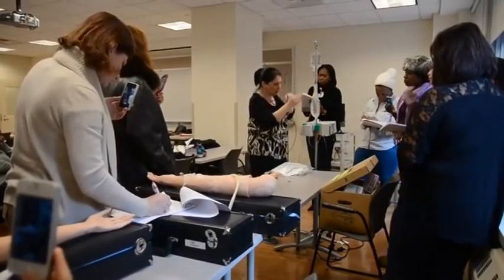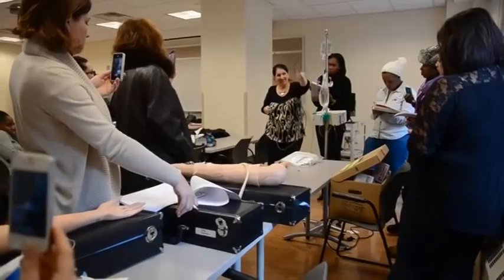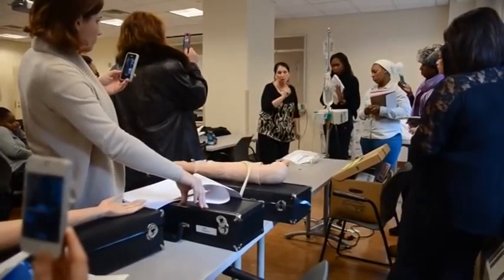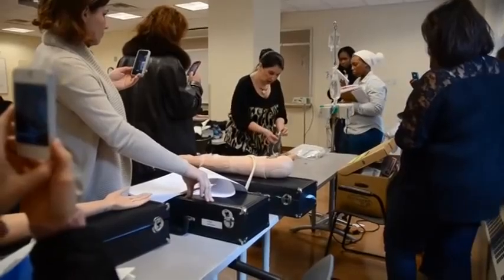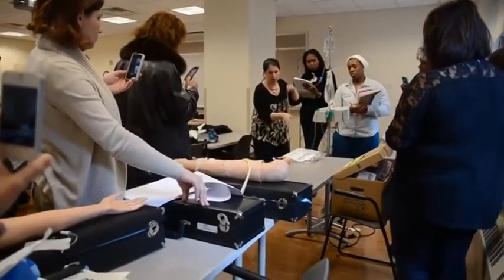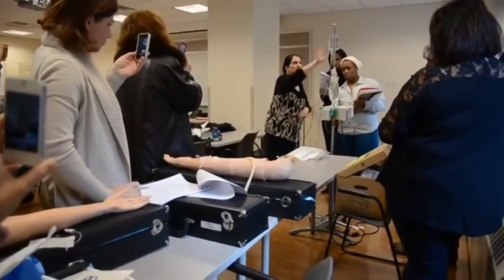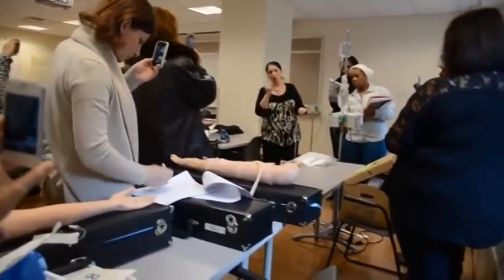For number four, it's also very good visually — if I'm walking in the hall and I see a patient and I want to know if they have an antibiotic, I can see this blue thing quickly. Number four has not stopped — this is running, whatever it was. I'm going to come in now and bypass the pump. I take my alcohol, clean it with alcohol, connect it. And now I'm going to regulate it from here — there's only one place you can regulate it from. This one is still going on the pump. You don't touch it. Now I figure out the rate again — it's 15. So 50 times 15 divided by 30 or 60.